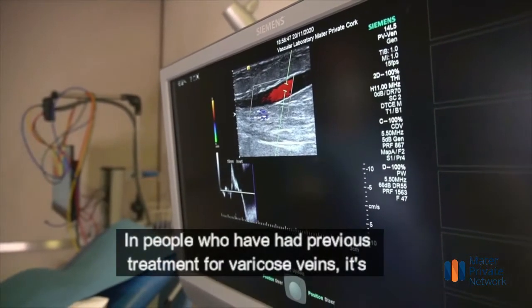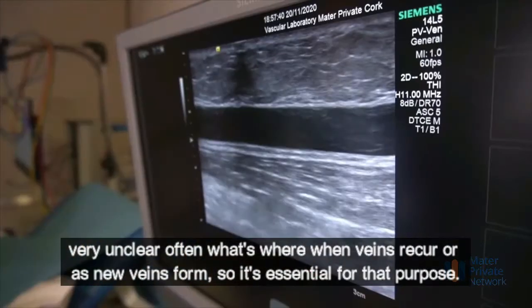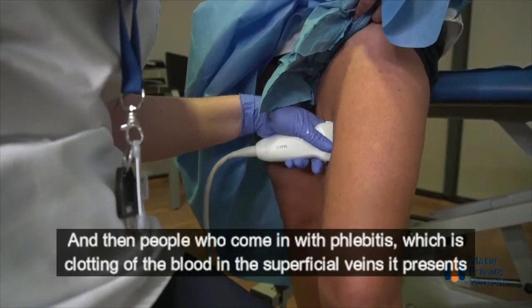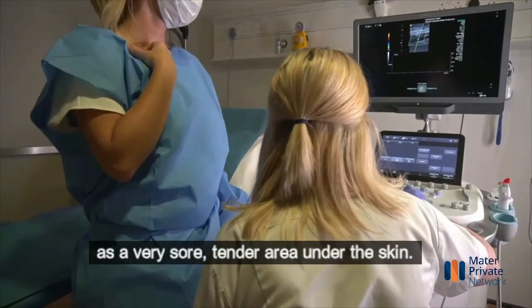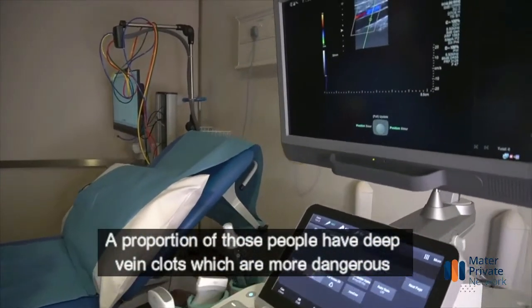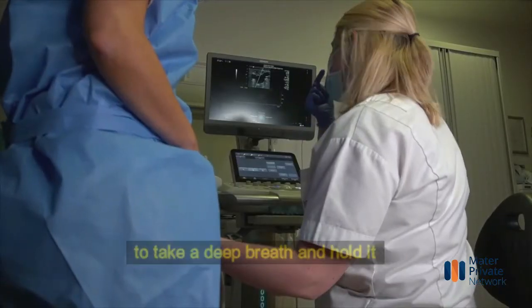In people who've had previous treatment for varicose veins, it's very unclear often what's where when veins recur or new veins form. So it's essential for that purpose. And in people who come in with phlebitis, which is clotting of the blood in the superficial veins, it presents as a very sore, tender area under the skin. A proportion of those people have deep vein clots, which are more dangerous, and they need to be scanned to check for that. So what I'm going to get you to do now is take a deep breath.